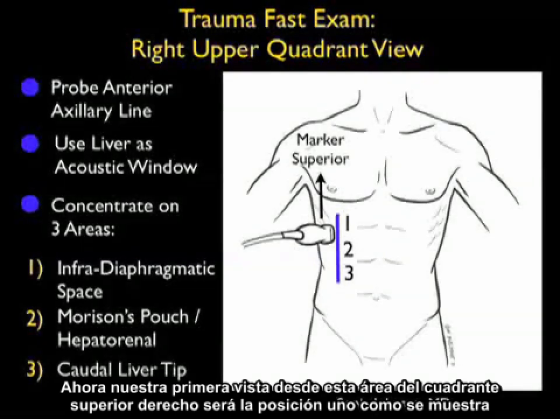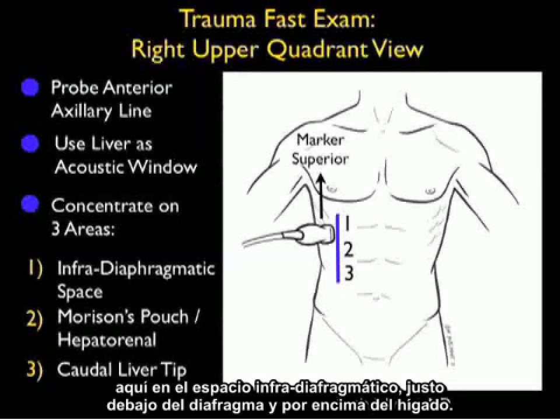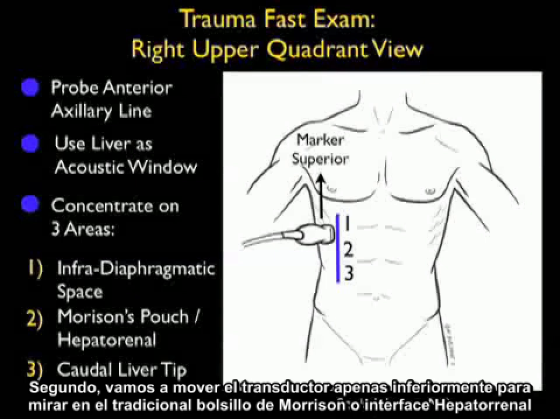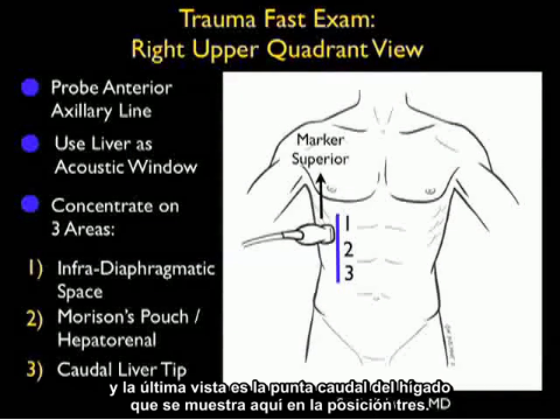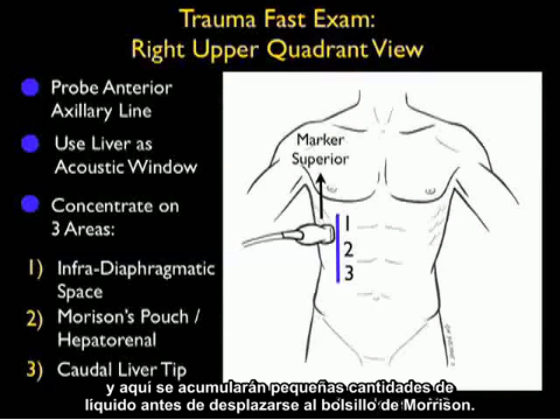Our first view from the right upper quadrant area will be position one, in the infradiaphragmatic space just below the diaphragm and above the liver. Second, we'll move the probe slightly inferiorly to look into the traditional Morrison's pouch, or hepatorenal interface. The last view is the caudal tip of the liver, shown here in position three. It's very important to look at the caudal tip of the liver, as this represents the beginning of the right pericolic gutter, and small amounts of fluid will pool here before moving into Morrison's pouch.